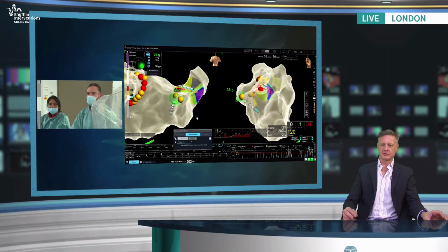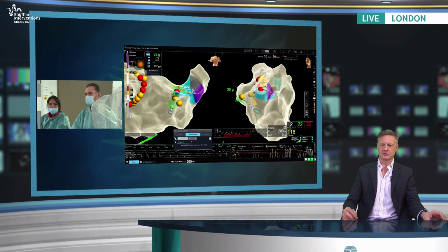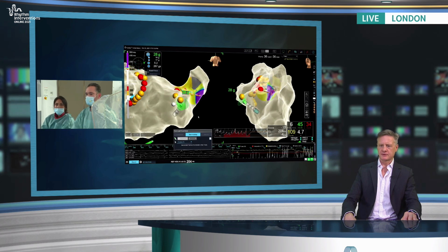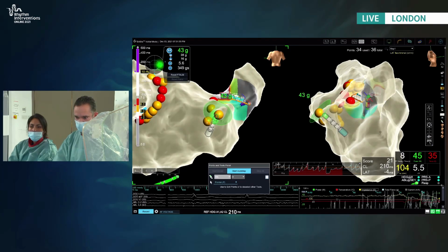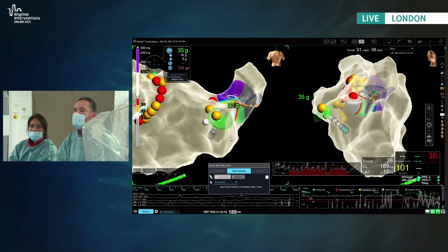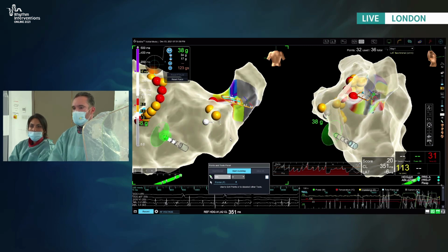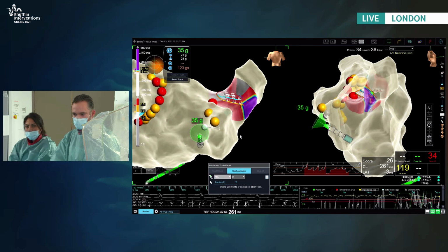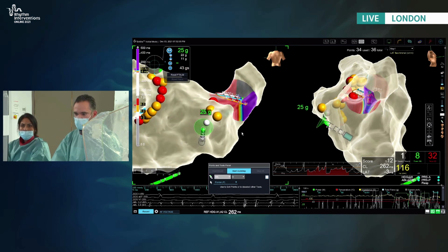We were looking at the review screen, Ross, of the BARD. I think they were trying to show us the post-ablation left pulmonary veins. Yeah, that was... Oh, it seems to have disappeared. Oh, there you go. That was the left upper post-PVI station. Was that what you were after seeing? Right. Yeah, so again, pretty silent.